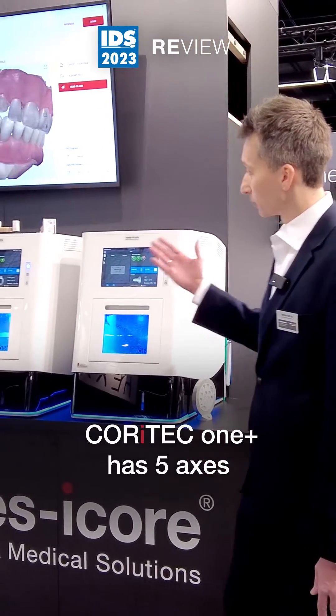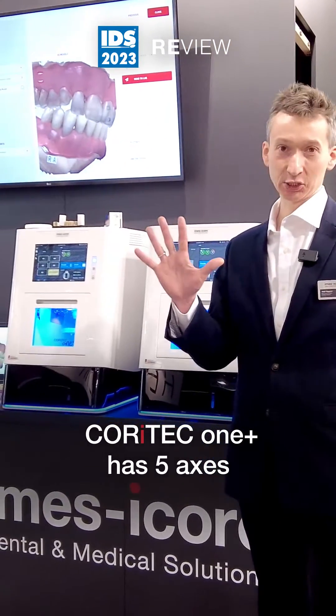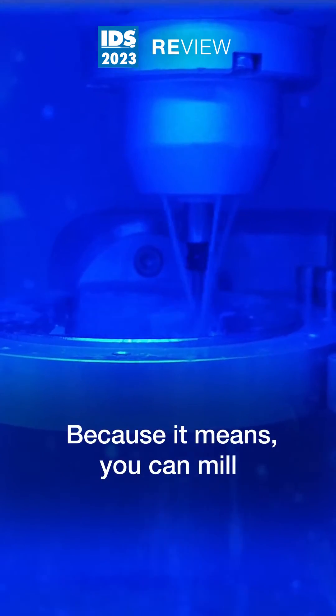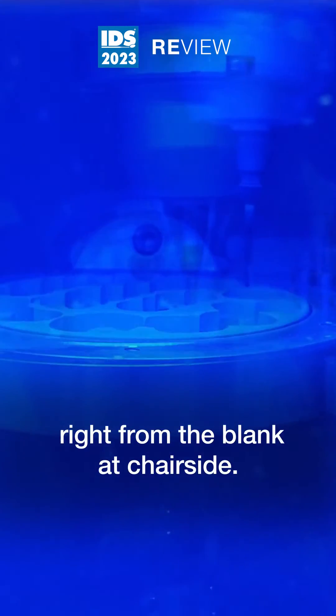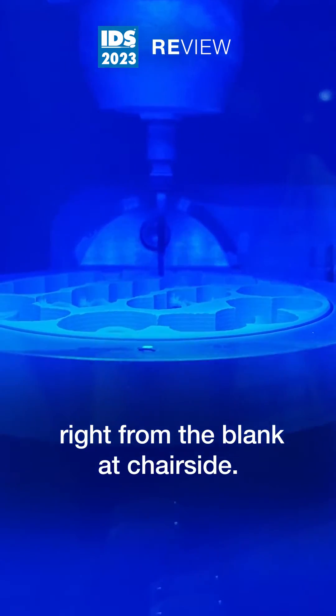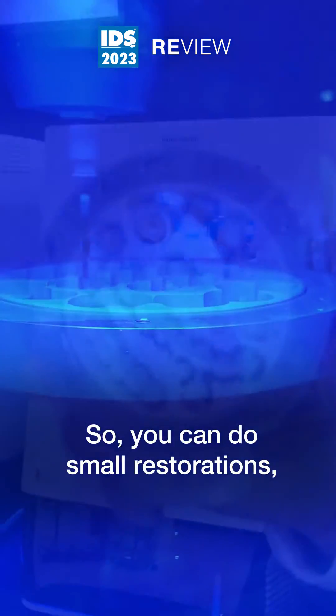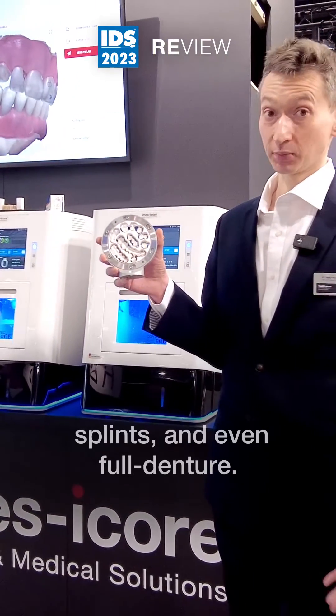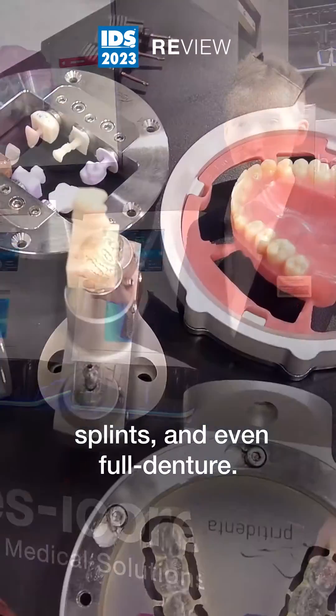Core iTech 1 Plus has five axes and this is really unique because it means you can mill right from the blank at chair-side. So you can do smaller restorations, pre-milled abutments, surgical guides, splints and even full dentures.